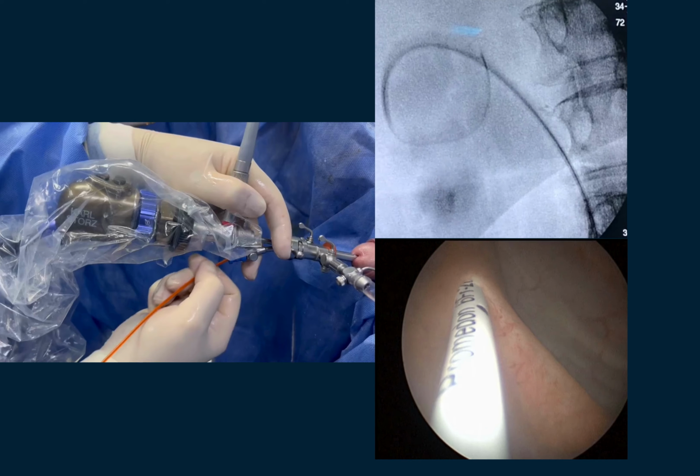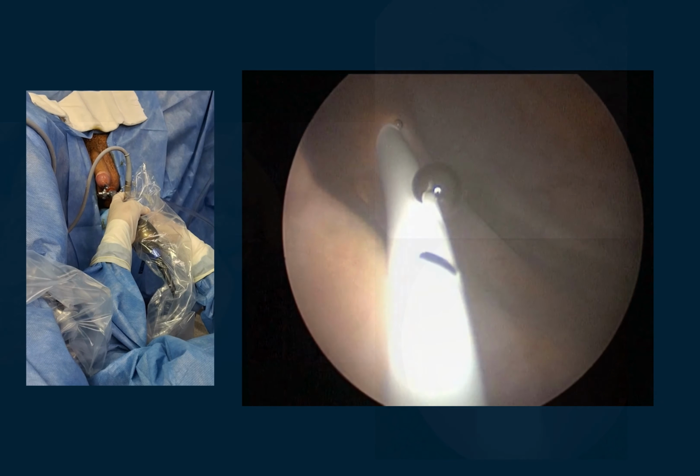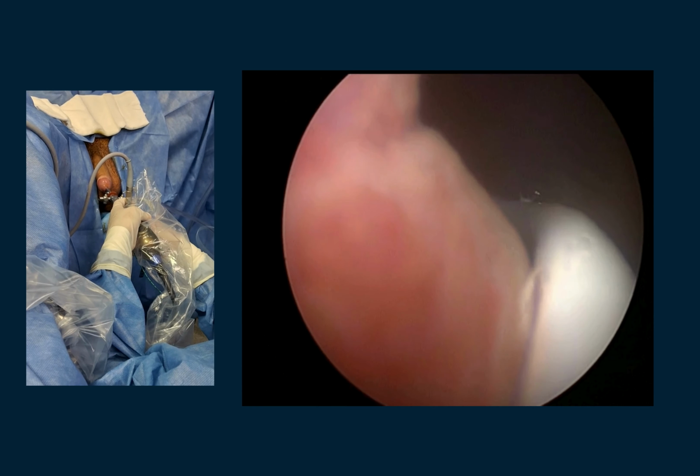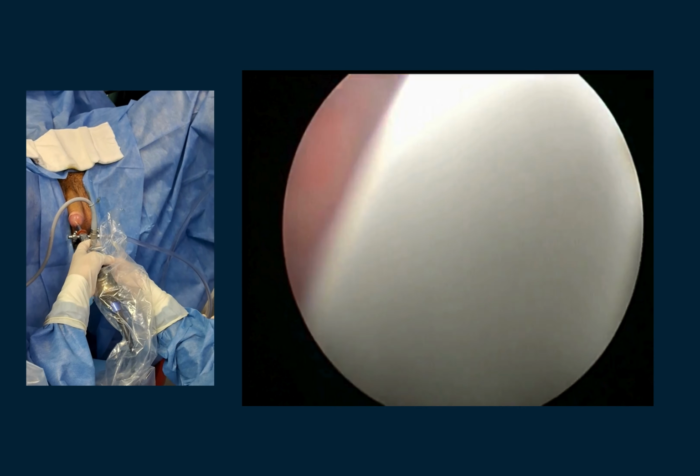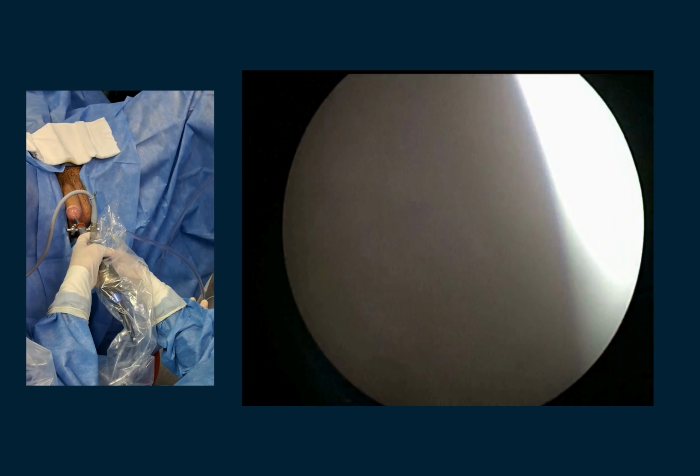To safely remove the pusher, first advance the pusher in a few centimeters until the distal stent tip has been pushed out of the cystoscope sheath and the end of the stent is visible completely inside the bladder.